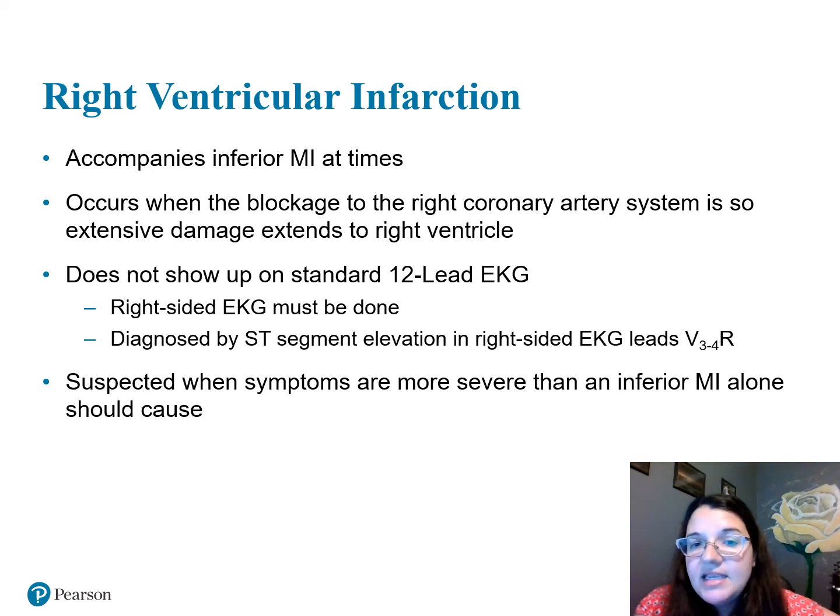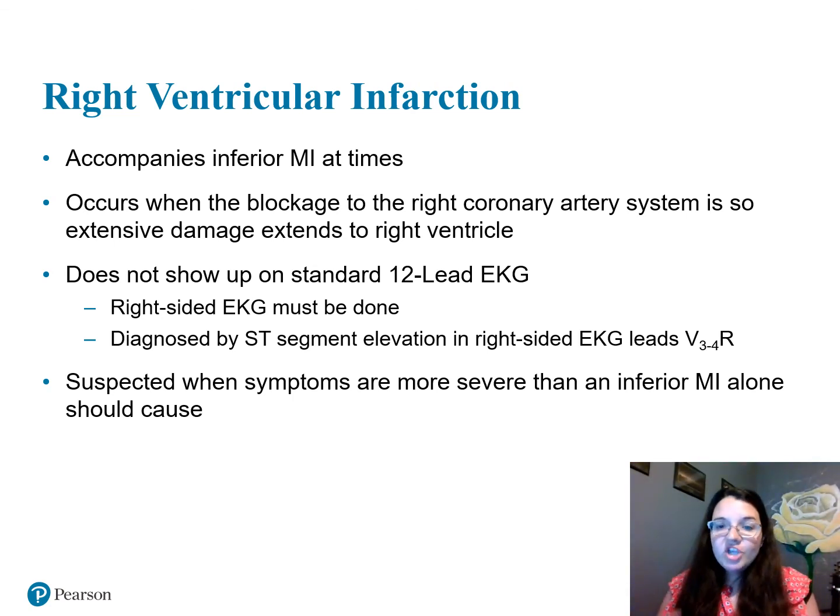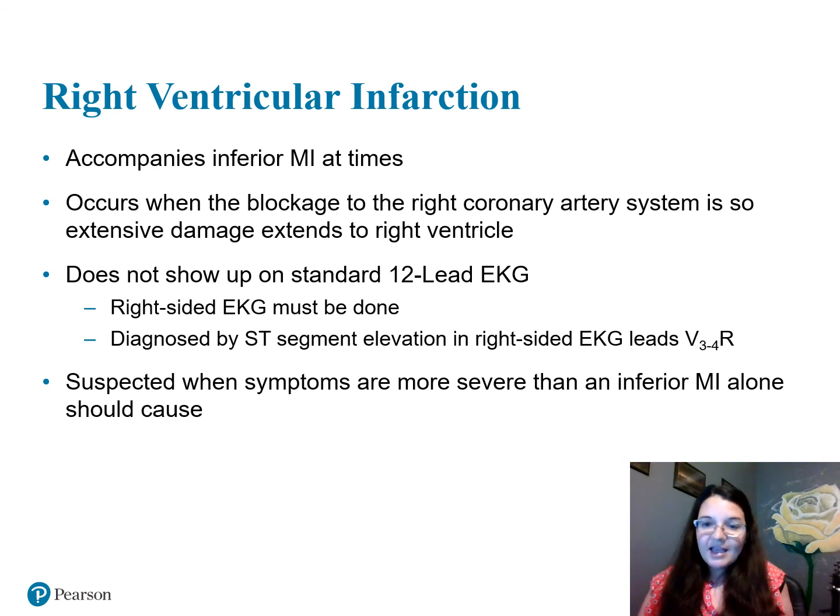A right-sided EKG must be done. Wait a minute, right-sided EKG must be done. What is that? So in class you learned about putting your electrodes on the left side, right? The only electrodes on my right were AVR and V1, but V2 through V6 and AVL and AVF, they were all on my left side.